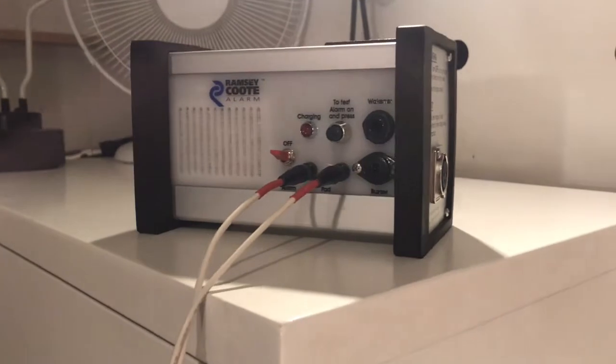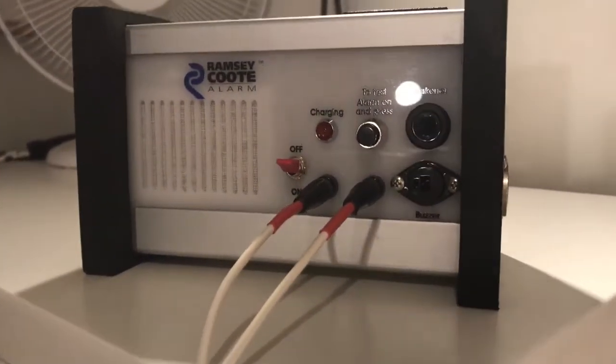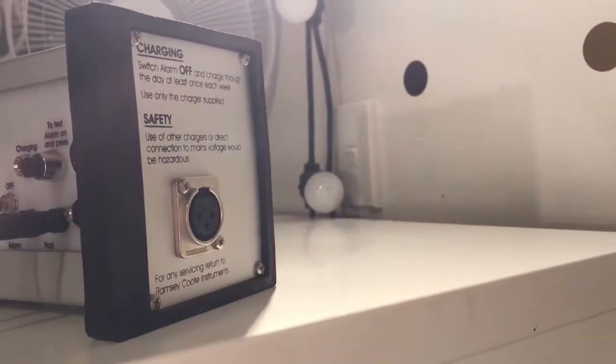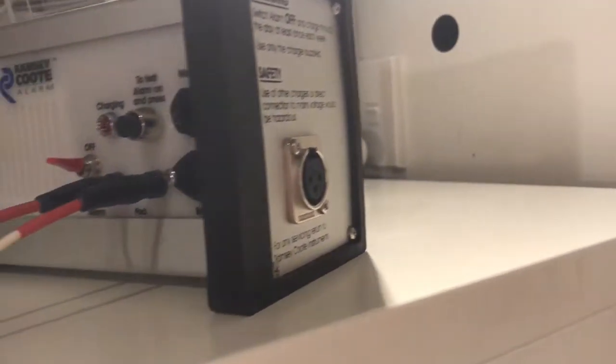The alarm is at the end of the bed so the child will have to wake up and get out of bed to turn it off. The alarm is not plugged into the power and it won't work if it is plugged into the power — it runs purely off battery.